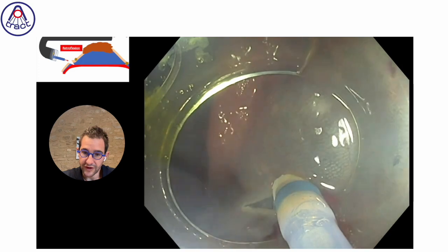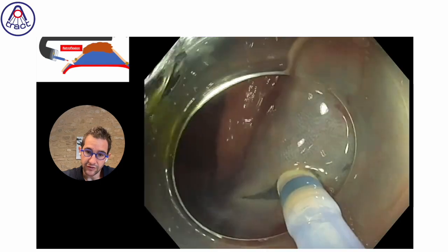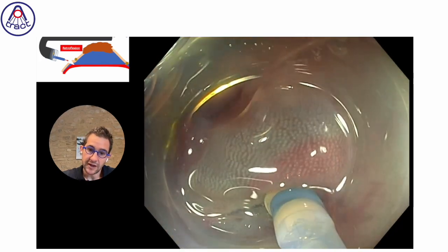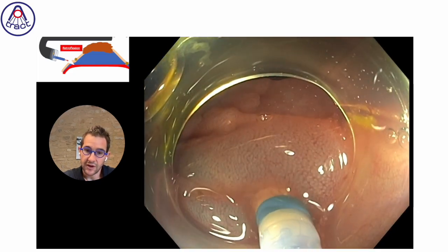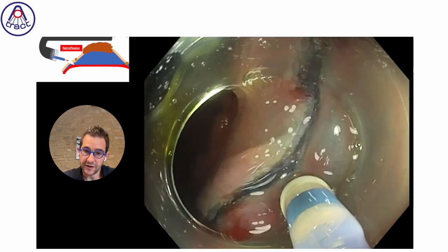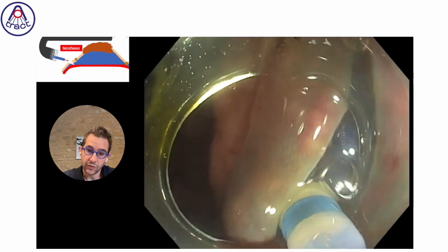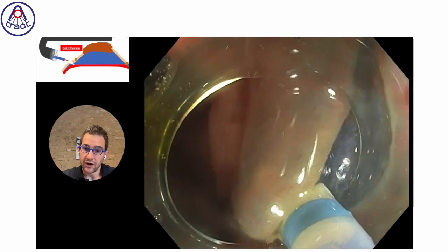First, you should find the good layer before moving too much. So first, I try to reach really the submucosal layer, the blue one, and after, I will pass into the hematoma in order to cut it completely and make it ooze outside, because once it is cut, it will be easier to see which vessel is bleeding and to obtain hemostasis of this area by doing coagulation. In fact, here it was a small oozing, and once we cut the hematoma, we clearly and quickly obtained the stop of the bleeding.